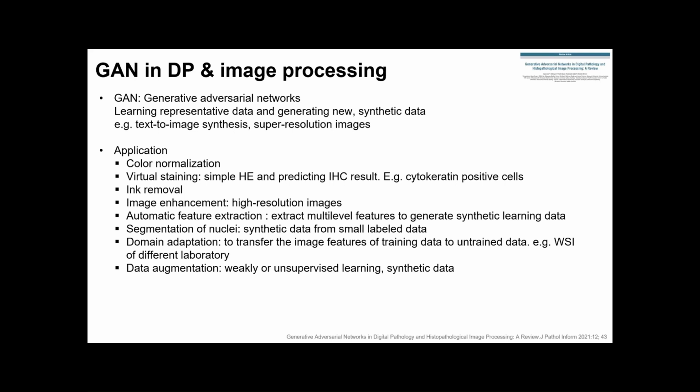Ink removal, or image enhancement to high-resolution images from low-resolution images or unfocused images, is another field to be applied.